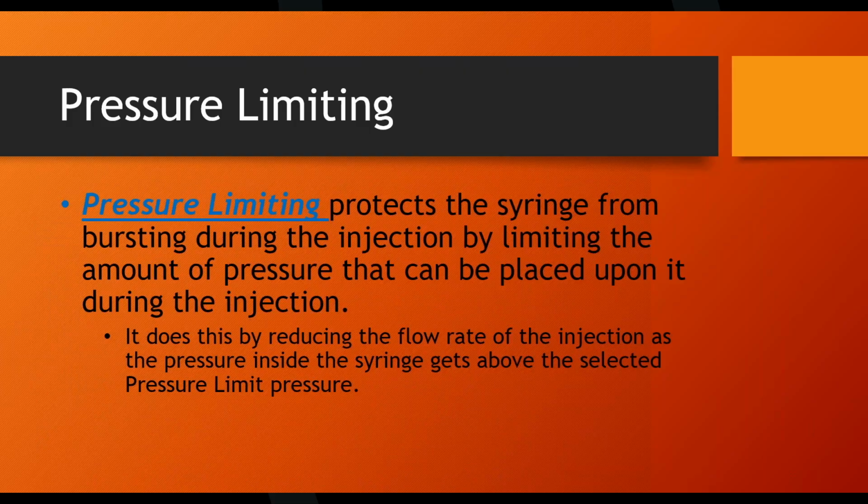There's only 2 exceptions to this rule. Every injector model, the syringe is unique to that model. Like this is a Stellant injector. Those Stellant syringes don't fit on anything else but a Stellant. Spectra Solaris syringes don't fit on anything but a Spectra Solaris. And that's like that all the way down the line. There's 2 exceptions to that, but it's pretty rare.